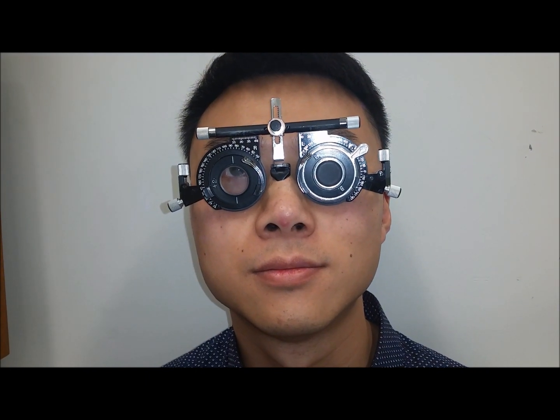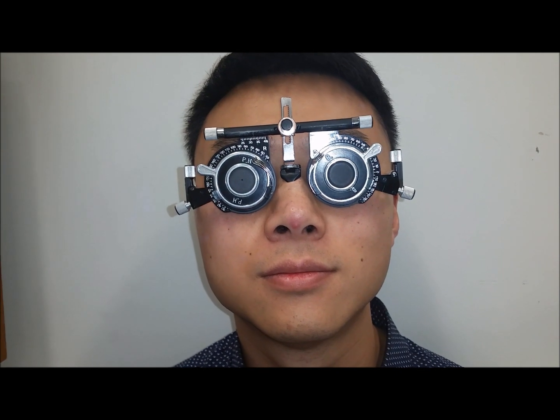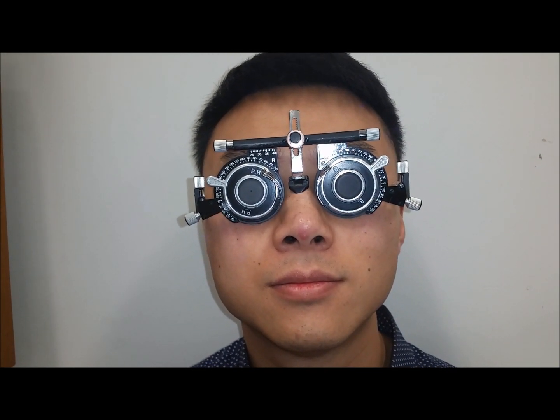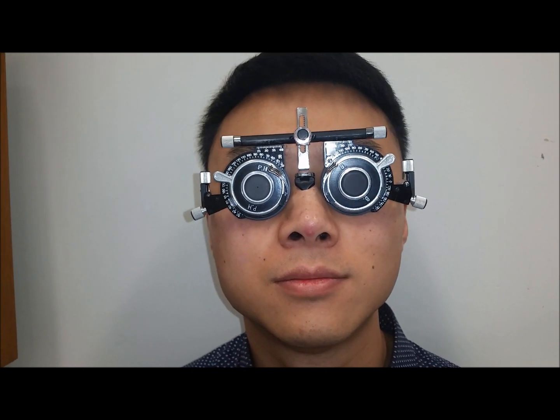The orthoptist then places a pinhole in front of the patient's right eye. The pinhole is used to assess the patient's potential best corrected visual acuity by blocking out the peripheral rays so that only the principal ray falls on the fovea, decreasing the size of blur circles.